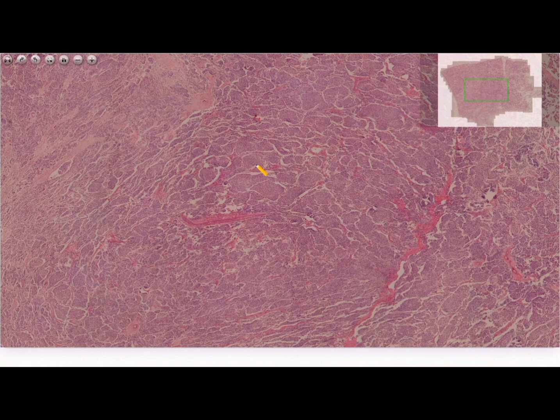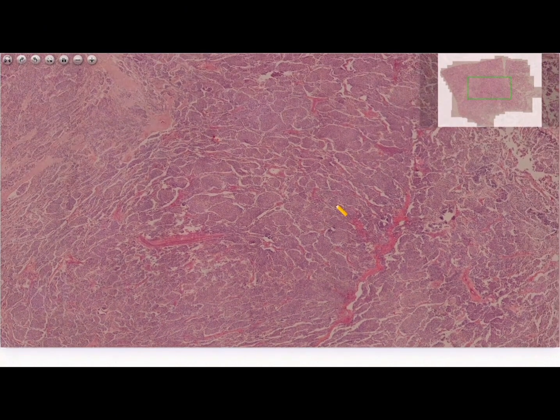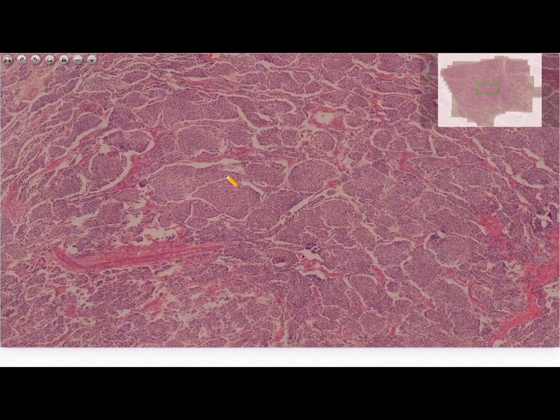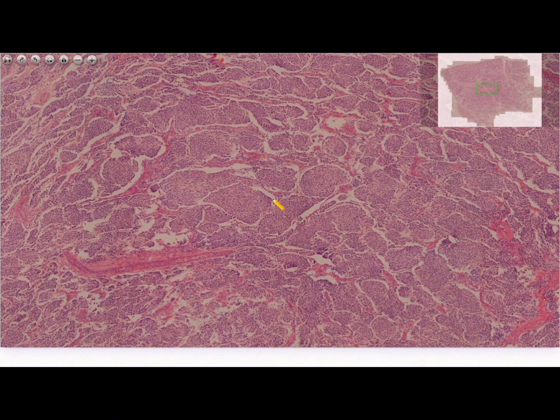Now let's see the microscope. When first scanning the microscopic slide of neuroblastoma under low magnification, one thing jumps out immediately. This is a highly cellular tumor, as you can see. We have an ocean of blue-purple dots, which are arranged in specific structures. These blue-purple dots represent the small round blue cells of neuroblastoma.